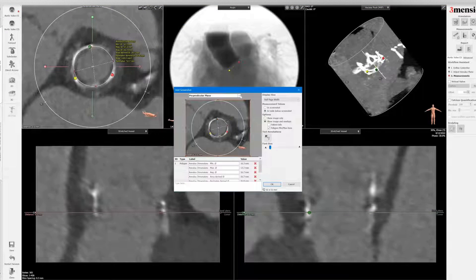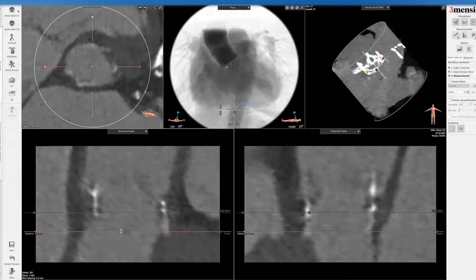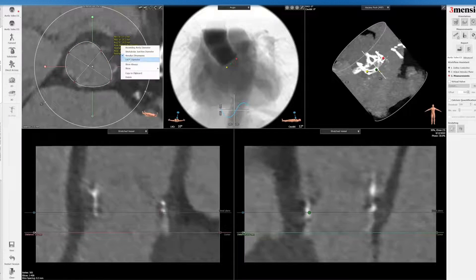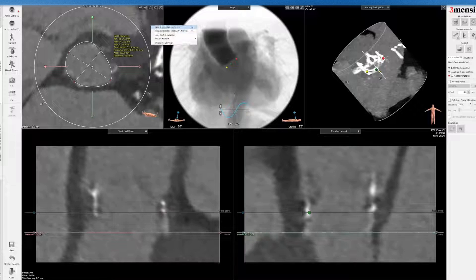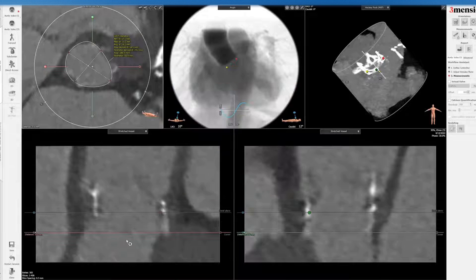I'm going to save this now in terms of the annular report, and then I'm going to the LVOT. With standard surgical valves, LVOT is not an issue unless you're trying to fracture or use a homograft. You can see the LVOT here in terms of conduction system impingement or potential LVOT injury.